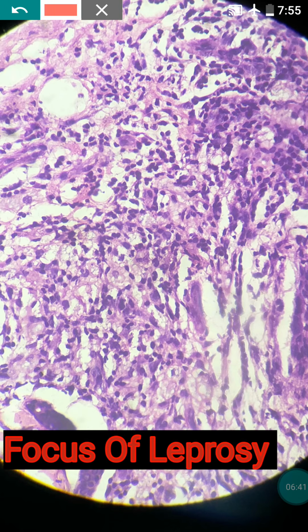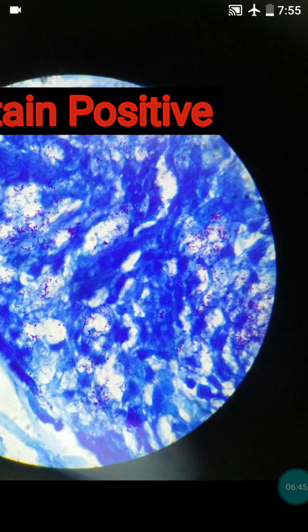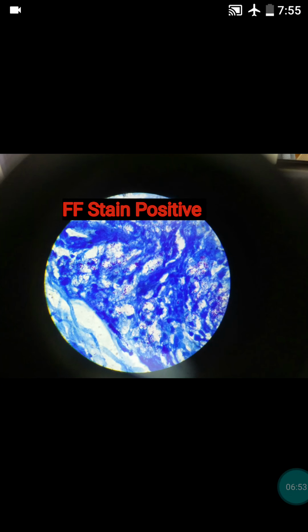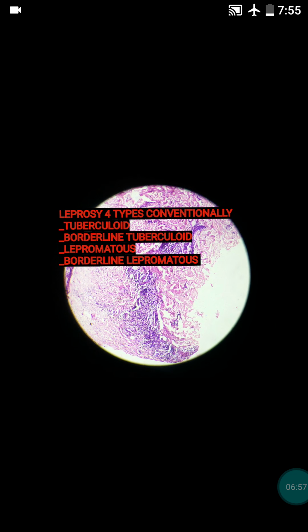If these two cell types are seen, the diagnosis is borderline lepromatous leprosy. We confirm the diagnosis with the help of Wade-Fite stain, where acid fast bacilli can be seen. So that is regarding the diagnosis of lepromatous leprosy, borderline lepromatous leprosy.